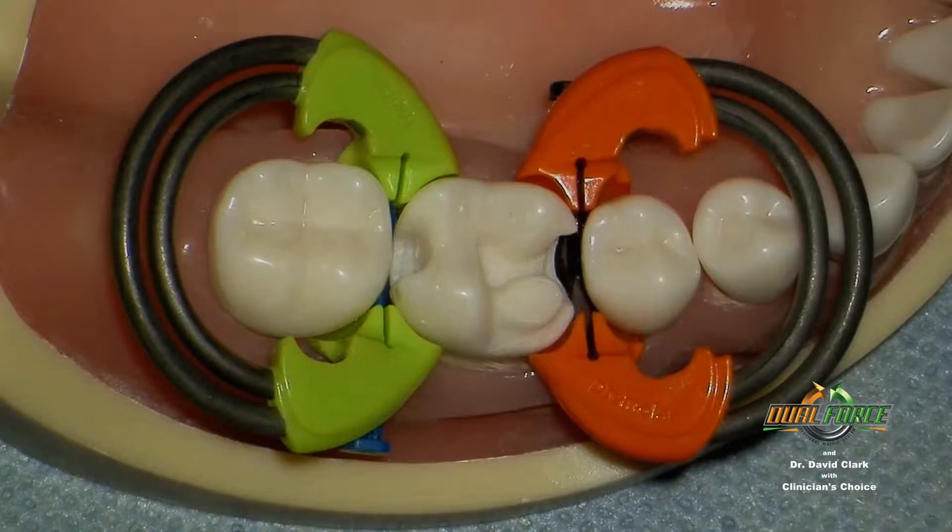Separators. Current separators require too much hand force because of crude springs or lack of engineering. Some of them are flimsy, and many lose their power quickly. They also lack the ideal stability and can tend to slip off the tooth.